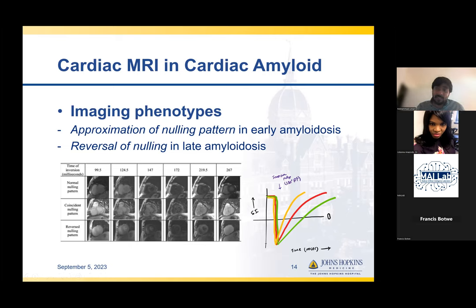And the longitudinal recovery is starting at the rate of the T1 properties of the tissue, depending on how much gadolinium that tissue is retaining. So blood pool obviously recovers pretty fast in a normal person because there's more gadolinium, T1 is short, you're going to cross the null point sooner in terms of milliseconds. Normal myocardium, the magnetization is going to recover rather slower than the blood pool. So there is a difference between the two null points.